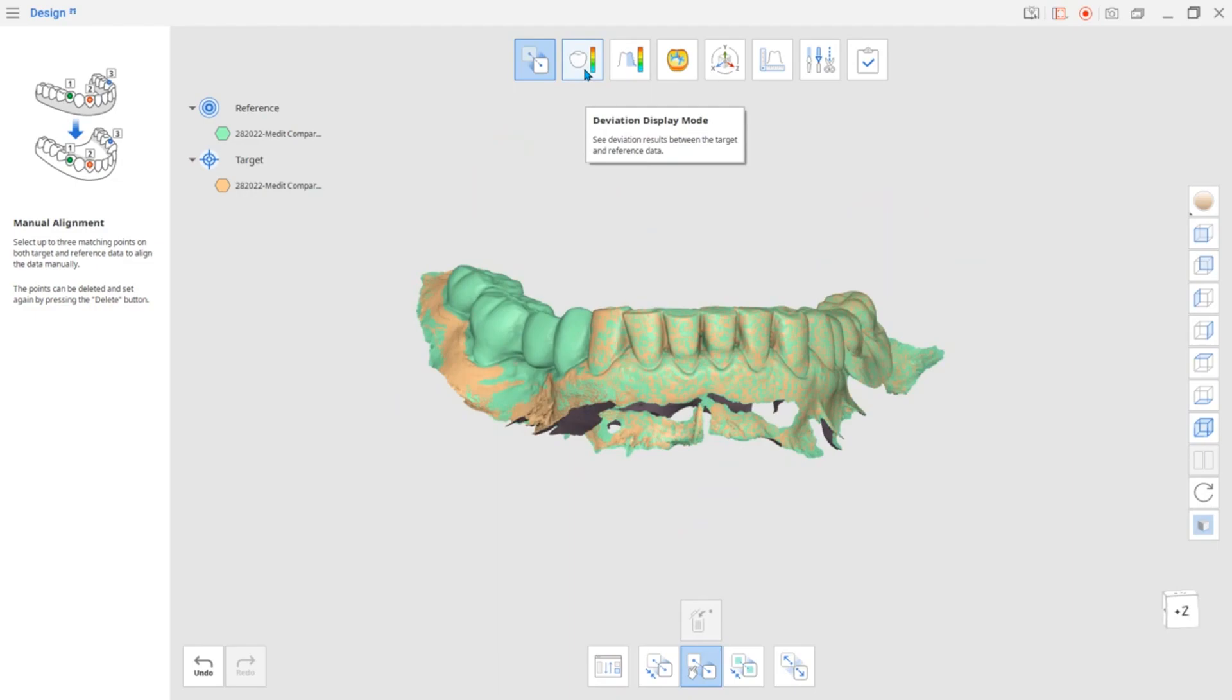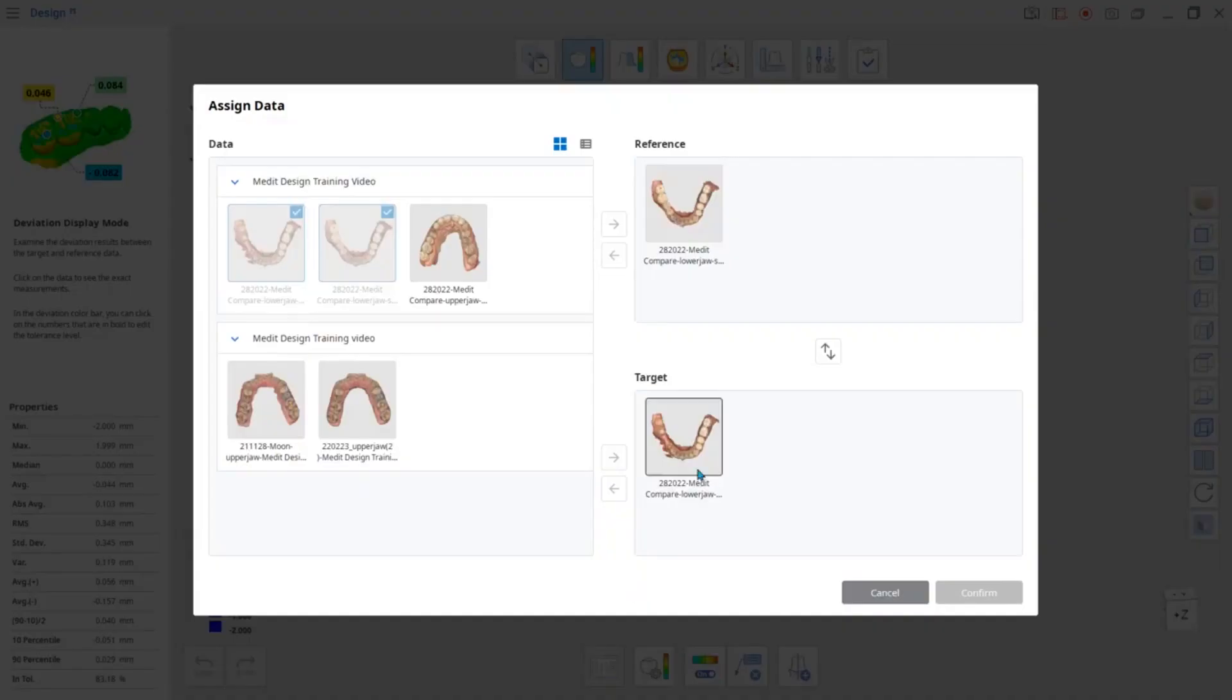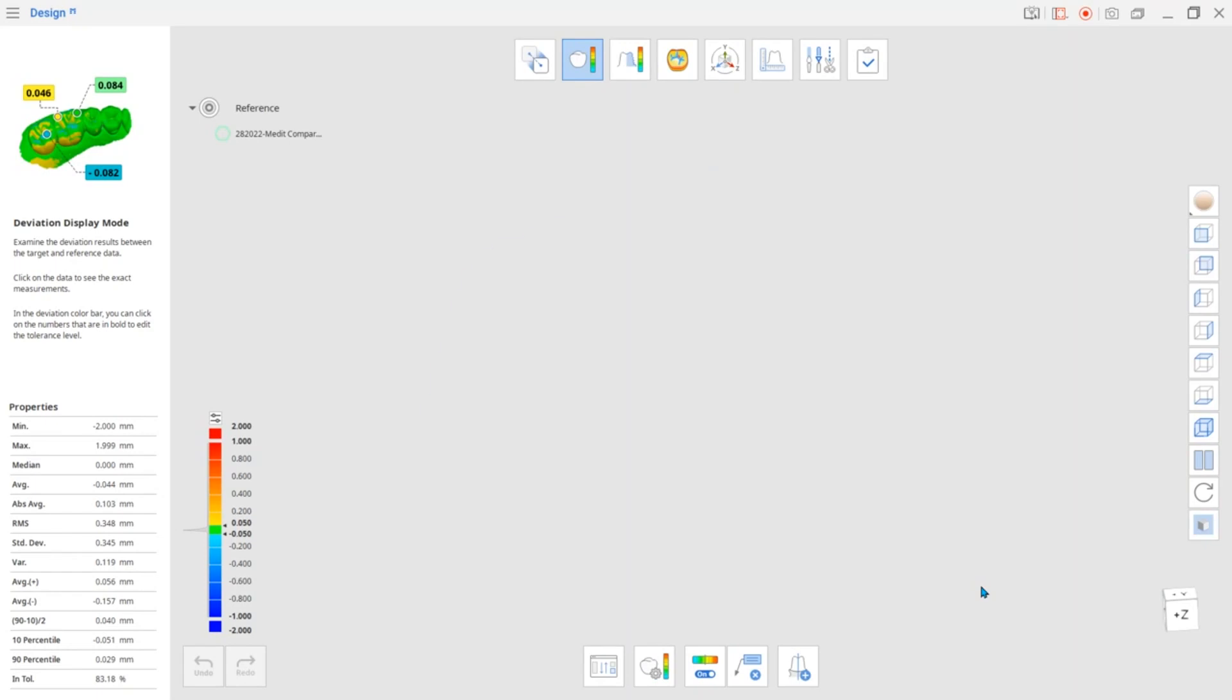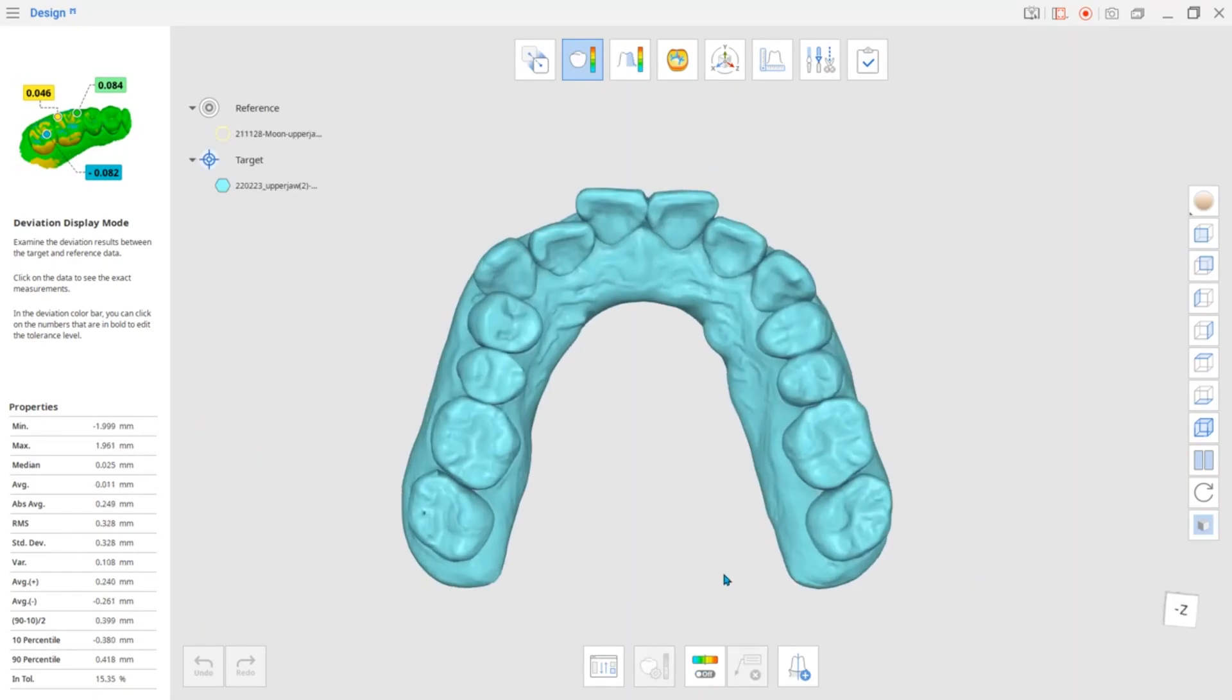Next is the deviation display mode. For this mode, you will be asked to assign reference and target data. Refer to the deviation color bar to analyze previously aligned data.